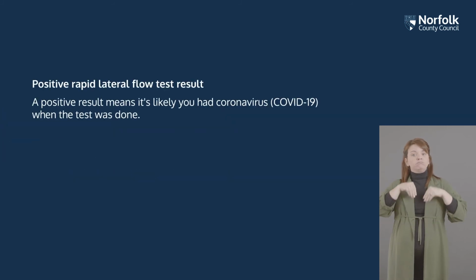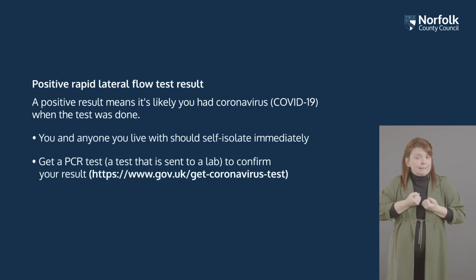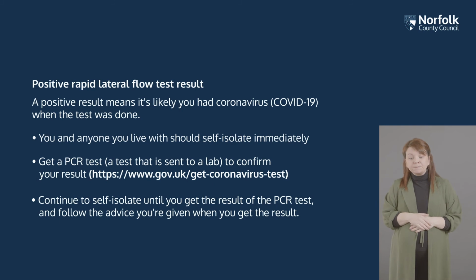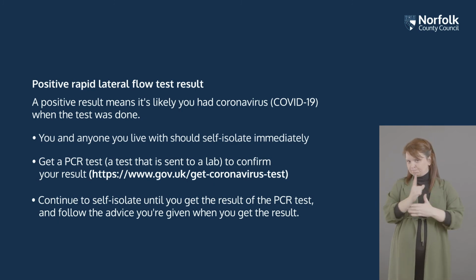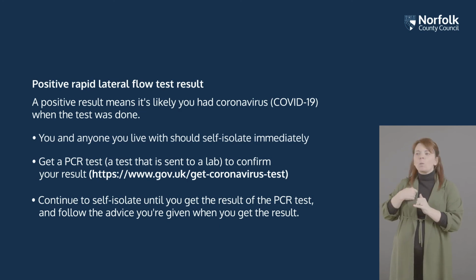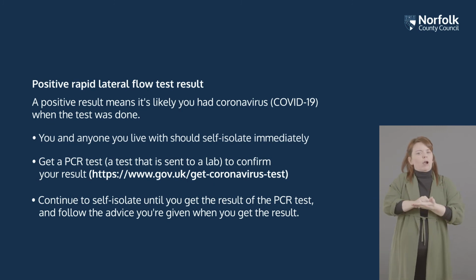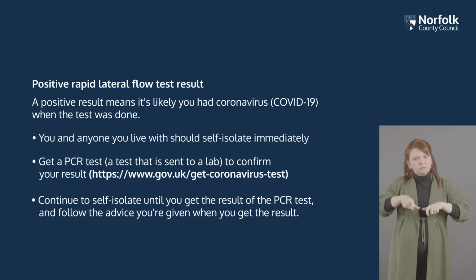Positive rapid lateral flow test result. A positive result means it's likely you had coronavirus, COVID-19, when the test was done. You and anyone you live with should self-isolate immediately. Get a PCR test, a test that is sent to a lab, to confirm your result. Continue to self-isolate until you get the result of the PCR test, and follow the advice you're given when you get the result.